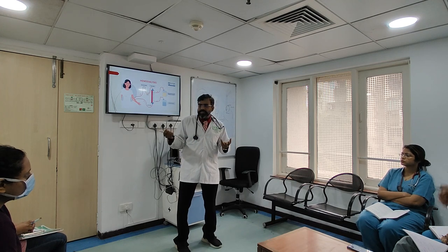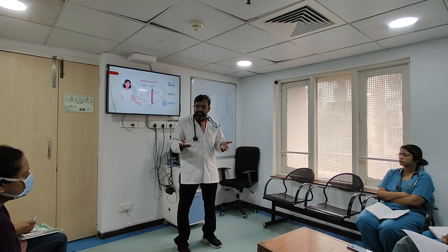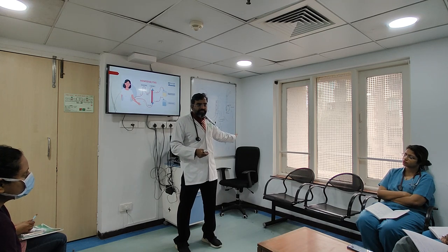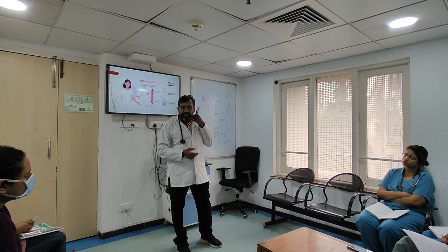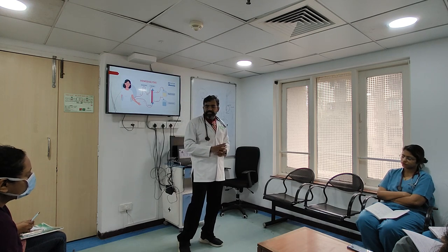So classically, nurses don't give it. If you ask a nurse when she's going to give the antibiotic, she'll say, "I'll give it after dialysis." She says that because it has been told to her. It is clear to her that she should not give it, and the reason is this. You as a doctor should understand the reason. So in a CRRT, it doesn't make any sense. You have a right-sided dialysis line and a left-sided jugular line. It really doesn't make any sense.